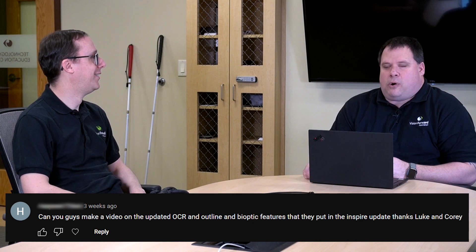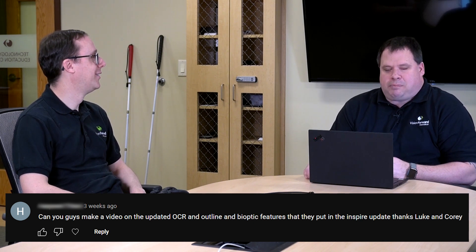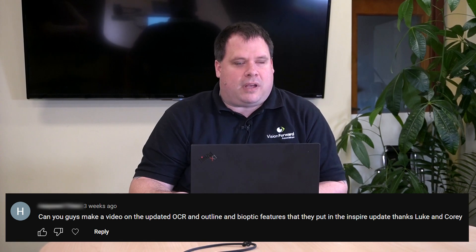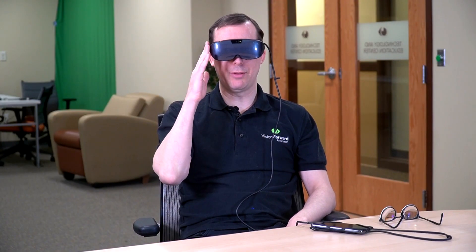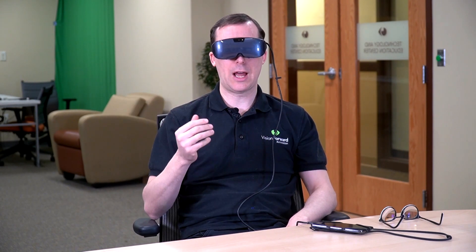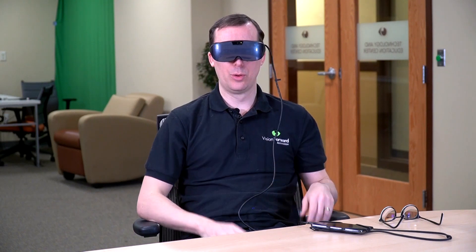Corey, did you hear that noise? I think we just got our first instructions through. You're absolutely right — it looks like our director is telling us what to do. He's saying: Can we do a video on the updated OCR, outline, and bioptic features and the new Inspire update? Thanks, Luke and Corey. What the director wants, the director gets. Let's do it. So the first new feature to look at in the Iris Vision Inspire is the bioptic mode. This mode is already available in Iris Vision Live, but it has just been added to the Inspire.